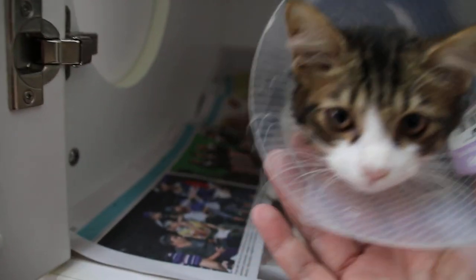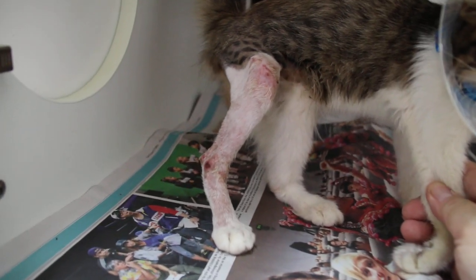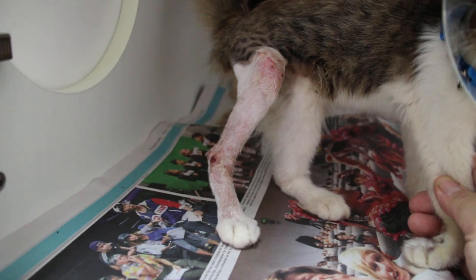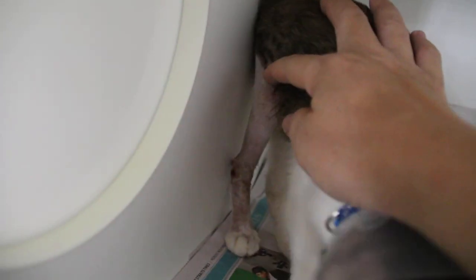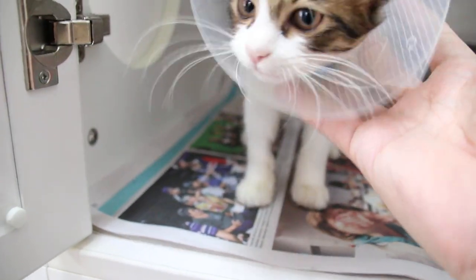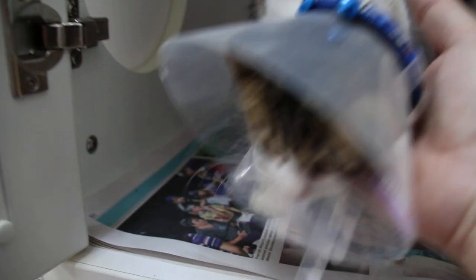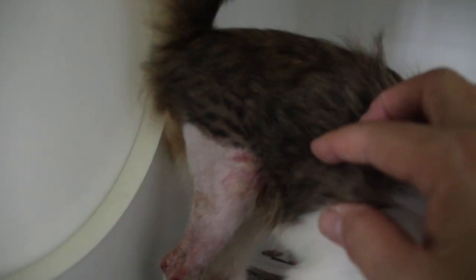It should be caged in for another four weeks for the bone to heal properly. You can see the femur joint here, and the pin is here — you can also see this on the x-ray from the previous video. The kitten has to wear the e-collar for another two to four weeks and is not allowed to jump so that healing can take place.